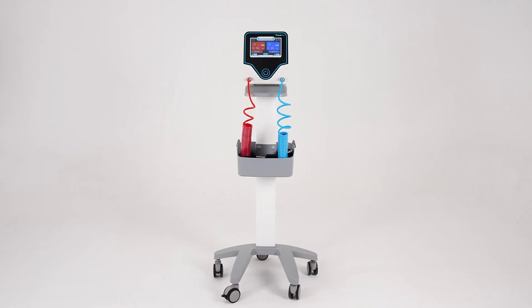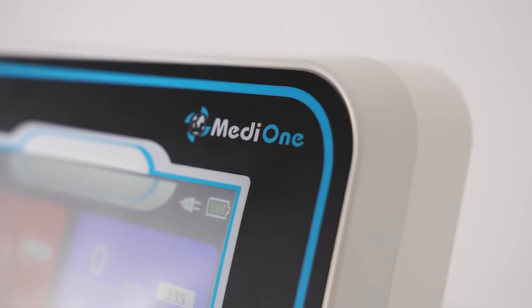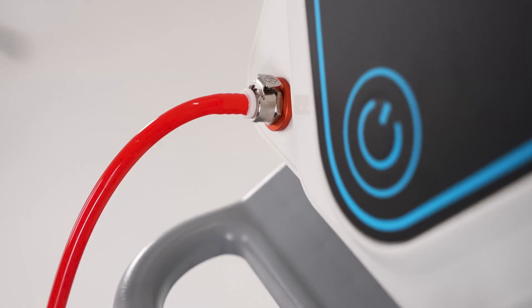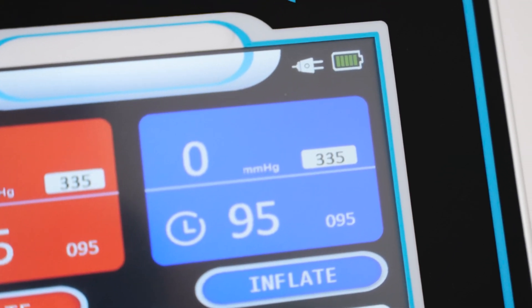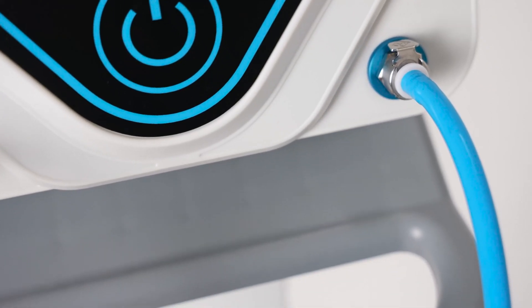Hello, I would like to introduce you to the MediOne TRQ 2022 automatic tourniquet device. Automatic tourniquet devices are used to stop the blood flow in a limb by creating environmental pressures on the limbs through the cuffs, and thus to perform surgical applications without blood loss.